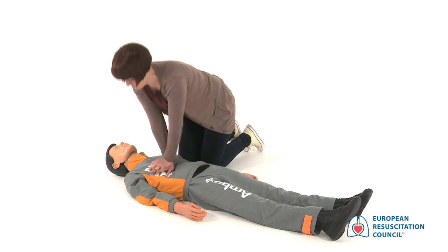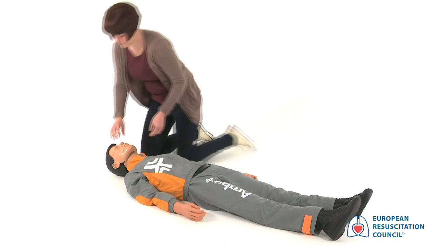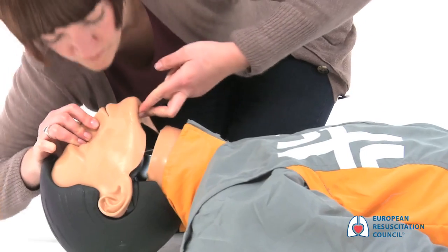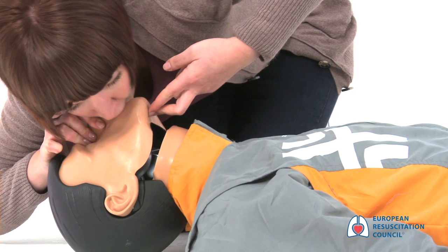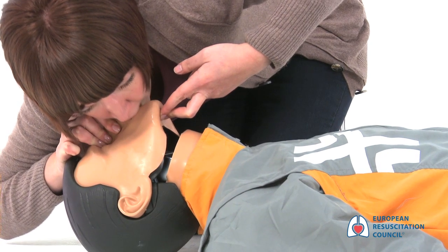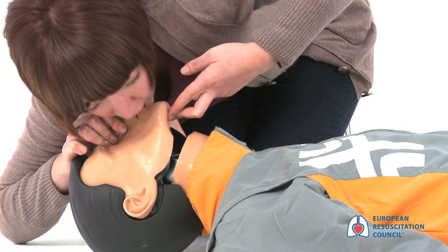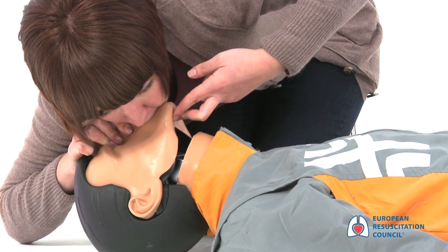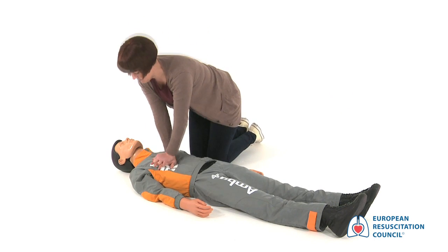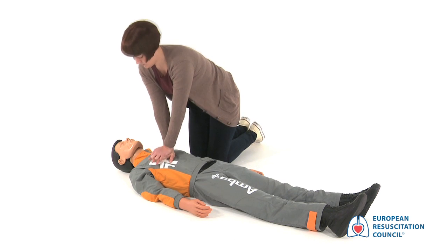After 30 compressions, give two rescue breaths. To do this, use the fingers of the hand performing the head tilt to pinch his nose closed. Take a normal breath yourself and place your mouth over the mouth of the victim. Breathe out for about one second until the victim's chest rises as if taking a normal breath. Allow the air to come out, then give a second breath. Continue delivering 30 chest compressions and two rescue breaths until professional help takes over or the AED arrives.